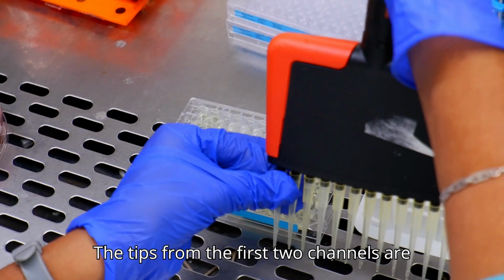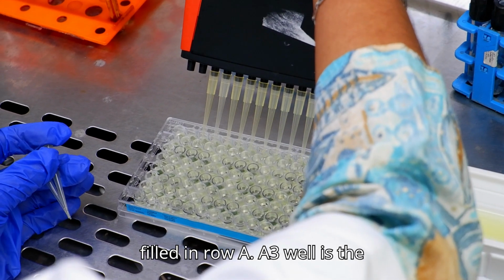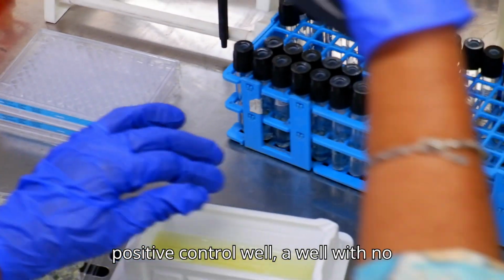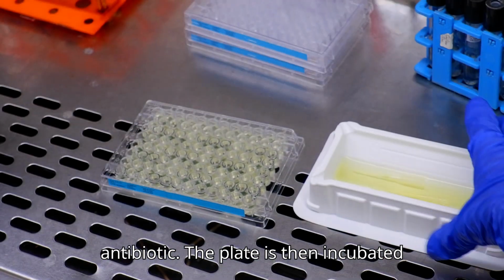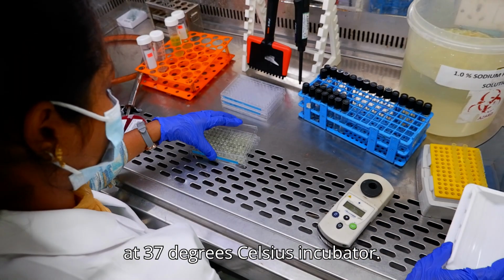The tips from the first 2 channels are discarded and the wells from 3 to 12 are filled in row A. A3 well is the positive control well, a well with no antibiotic. The plate is then incubated in a 37 degrees Celsius incubator.